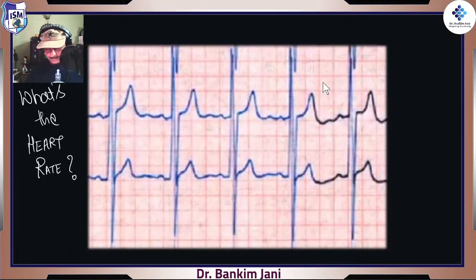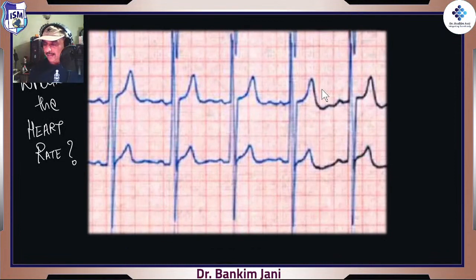Let's do it. Here it is. What's the heart rate? Let's find out. So we take one wave. Right now, let's take this and here. Let's take this wave, here and here. We are not worrying much right now, we just watch visually that two waves should look alike, and we take the difference.